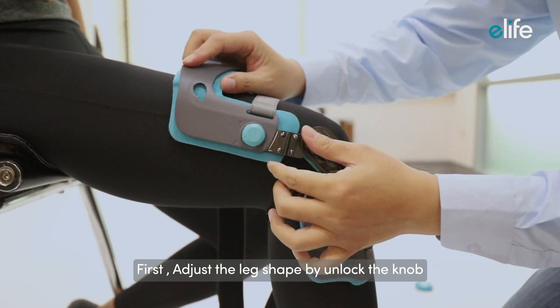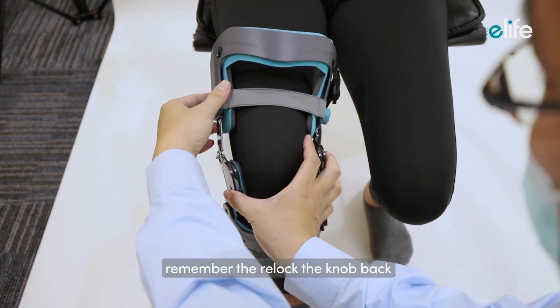First, adjust the leg shape by unlocking the knob. Remember to relock the knob back.